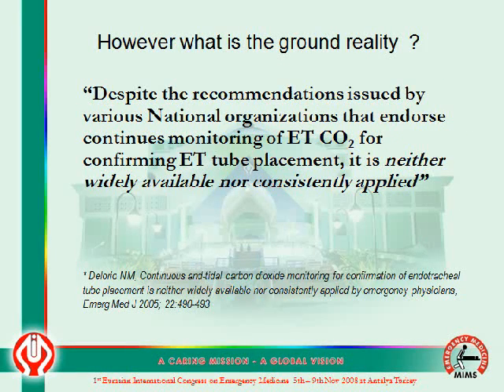Several international agencies, journals and experts recommend that EDD, not EDD, ETCO2 is the method of choice to confirm the tube position. Then what about the ground reality?